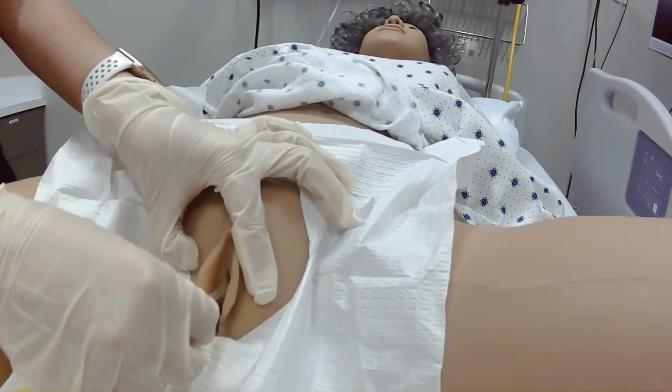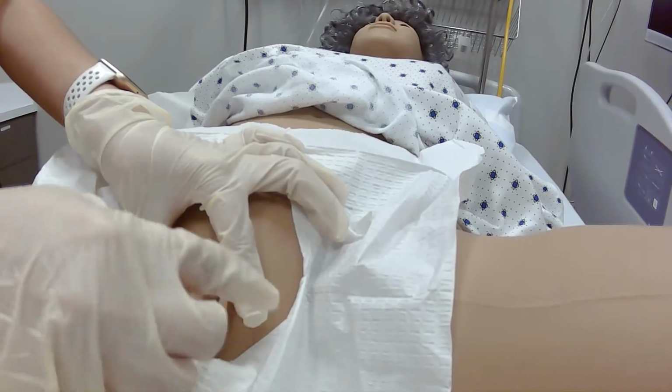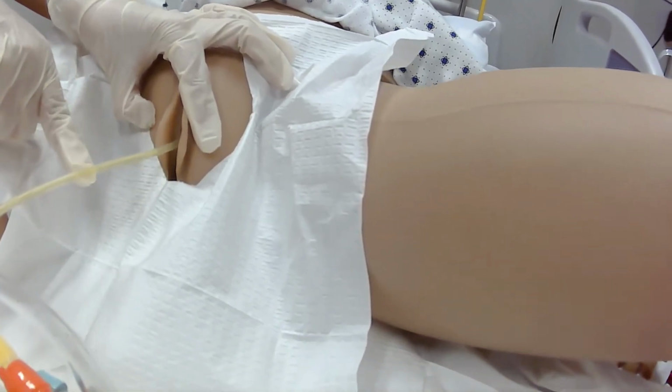Inches for a female patient, or 7 to 8 inches for a male patient. But generally our indicator is when you start to see urine. So you should see that urine coming out of the catheter.